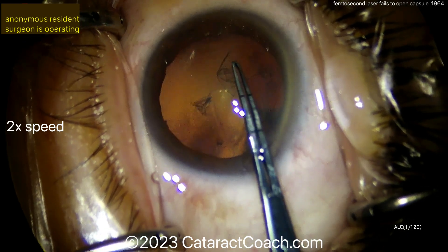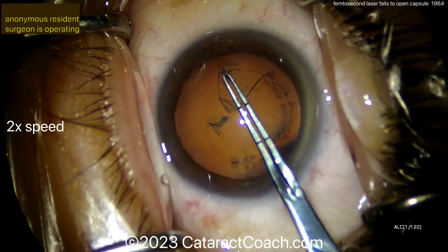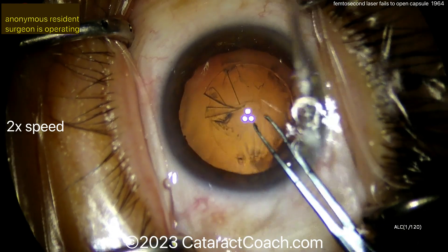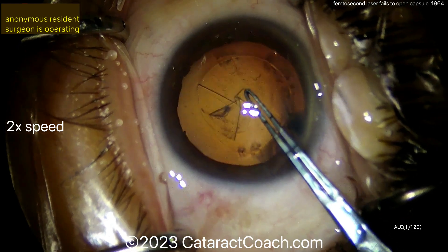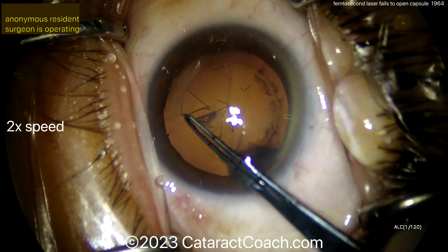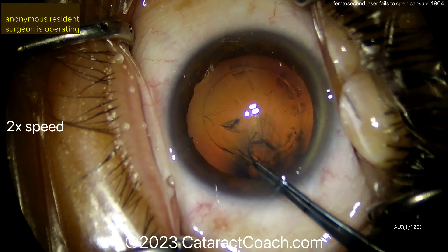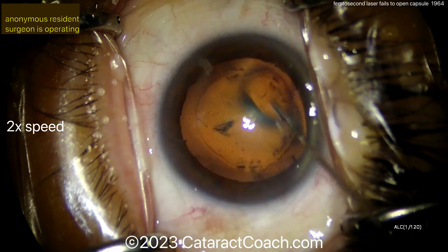Make a generous, large rhexis — at a minimum on top of those spots, but even better slightly larger than those spots. By doing that you ensure there's no capsule weakness and no perforations remaining. You can see the forceps are marked so you can measure the size, and it's a nice round rhexis — it looks really quite good. The video has been sped up a little bit, and now we'll get to the cataract case, which is going to be pretty straightforward.